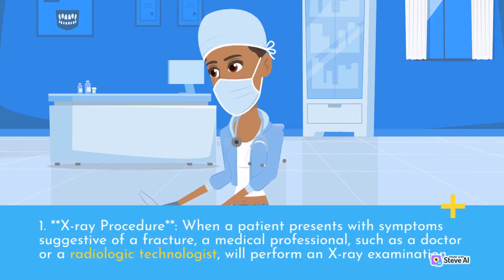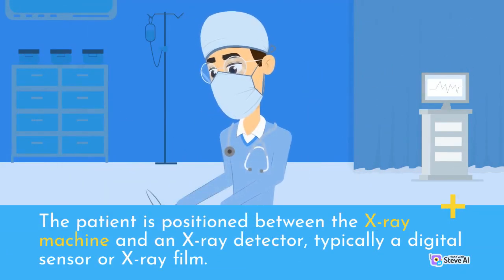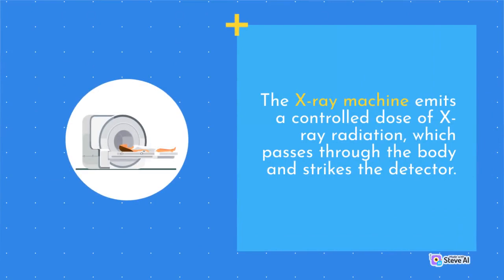1. X-ray procedure. When a patient presents with symptoms suggestive of a fracture, a medical professional, such as a doctor or a radiologic technologist, will perform an X-ray examination. The patient is positioned between the X-ray machine and an X-ray detector, typically a digital sensor or X-ray film. The X-ray machine emits a controlled dose of X-ray radiation, which passes through the body and strikes the detector.